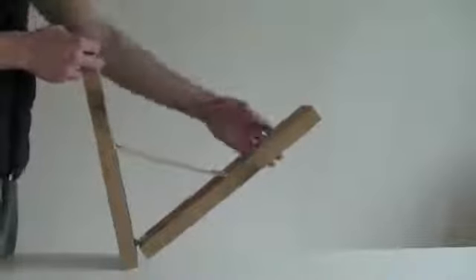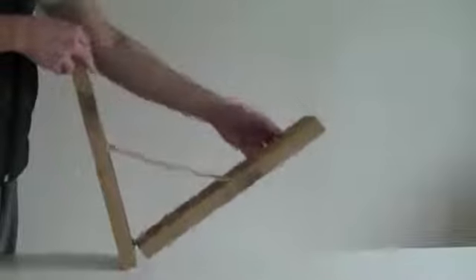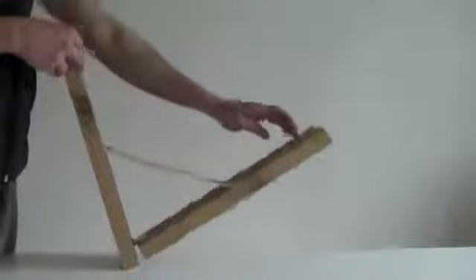For this reason, it's important that we apply the dynamic tape in the shortened position as we said, but also apply it along the length of the lever or as far as we can down the lever to increase that mechanical effect as much as possible.